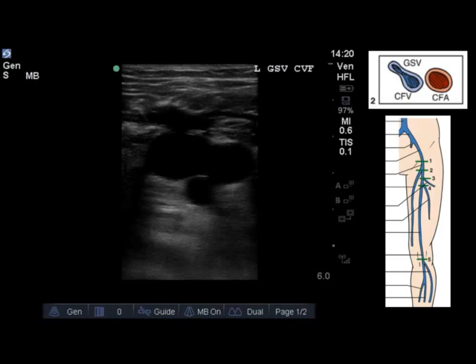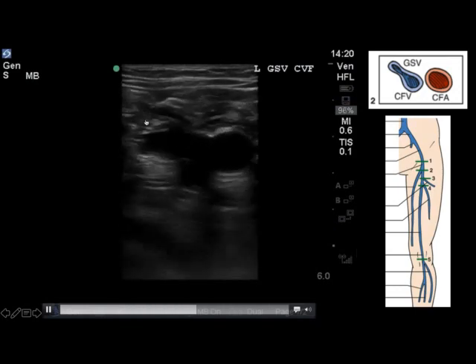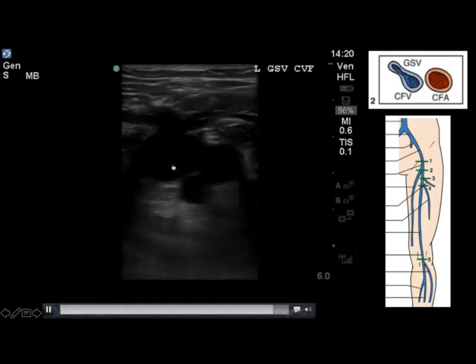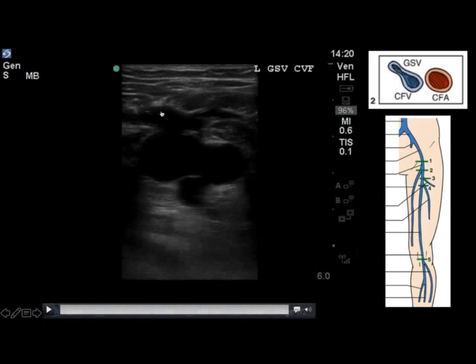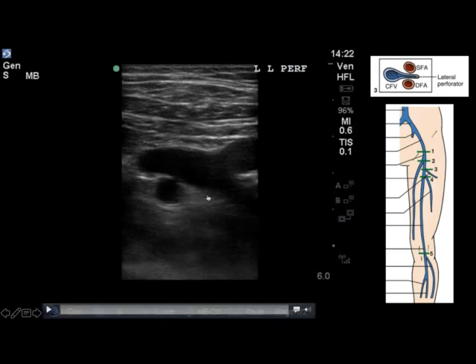The next key point of vascular bifurcation is where the left greater saphenous vein takes off from the common femoral vein. Left of the screen is medial. You have the common femoral vein with the greater saphenous vein moving superomedially off it and the common femoral artery to the right. The next step is to scan the proximal few centimeters of the greater saphenous vein to ensure there's no clot hiding there before moving to the level of the left lateral perforator.